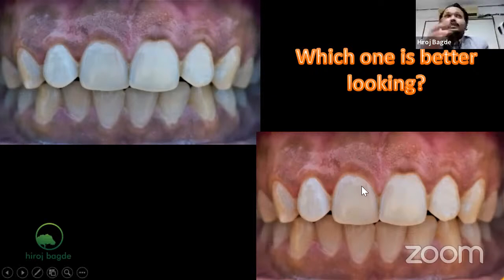So what I did, I took a gray card and then post-processed it, which means I processed the image. That processing takes place in software. But for that, we need a gray card held just beside the teeth, so that whenever I have taken a gray card image, I will be able to adjust the color settings from this to this. Now the color settings are changed with the help of the gray card to this. Now this is supposed to be what is seen inside the oral cavity.